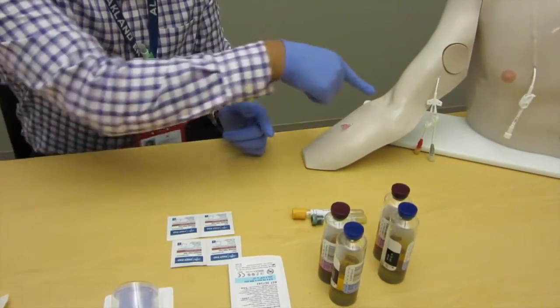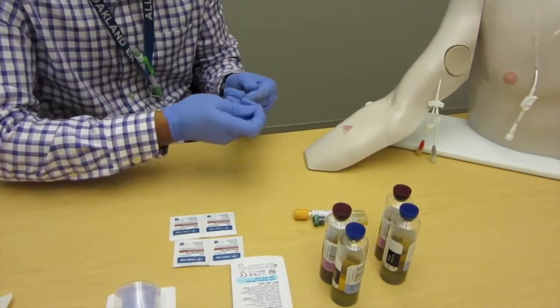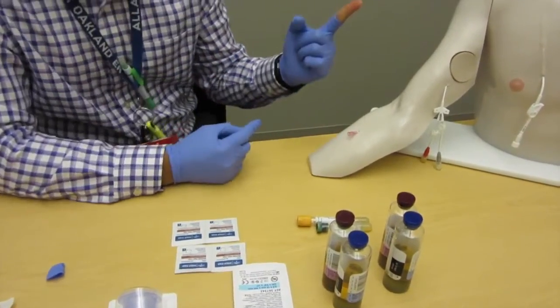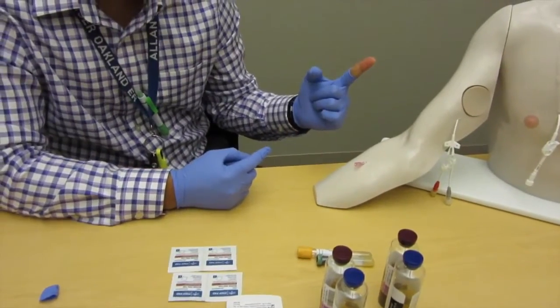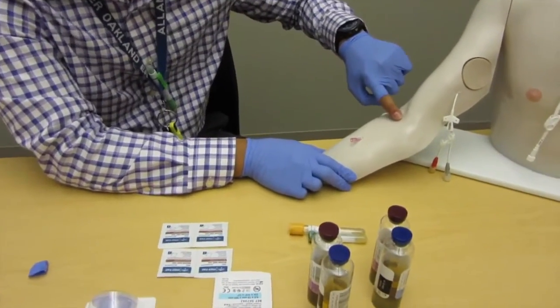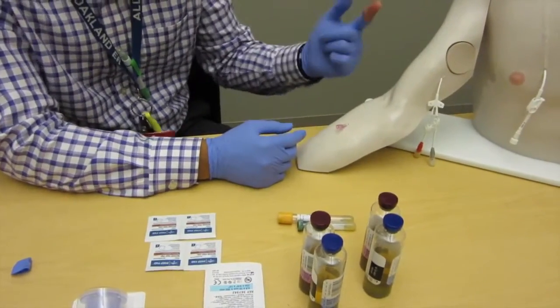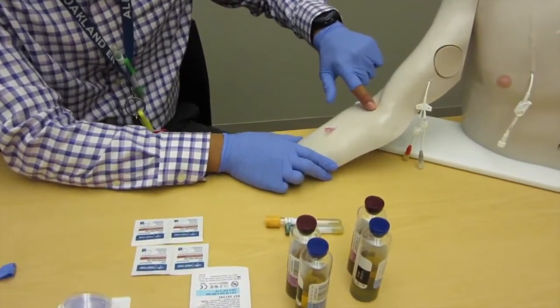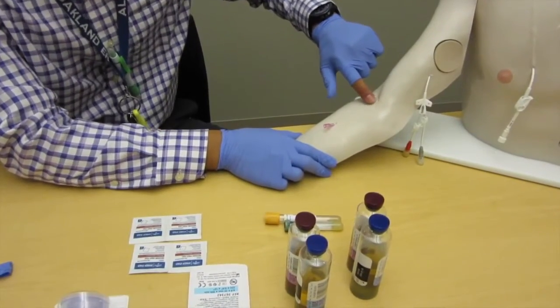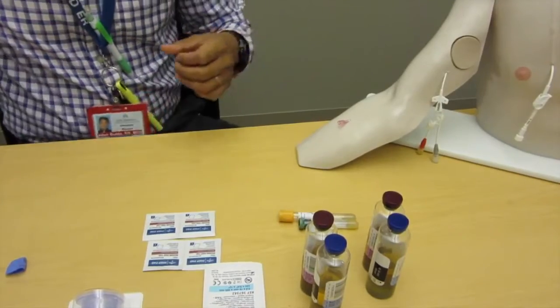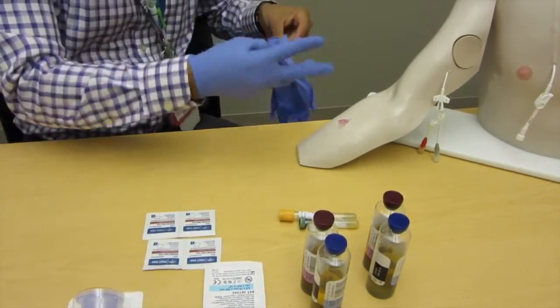Here's another improper technique: you just scrubbed and let it dry. A lot of times when trying to find a vein on a tough stick, you don't want to take off the finger of your gloved hand and start feeling for it, because now you just introduced bacteria right on the area that you just scrubbed. Please refrain, even if it's a tough stick, from touching with your bare finger.